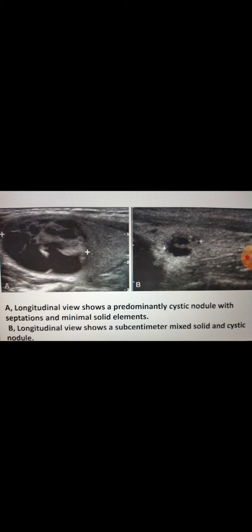So just remember that a solid hypoechoic nodule that contains one or more of the malignant features would have 50 to 80% risk of being a cancer. And there is a minority of papillary cancer that can have cystic components, and these can overlap in appearance with the benign nodular hyperplasia.